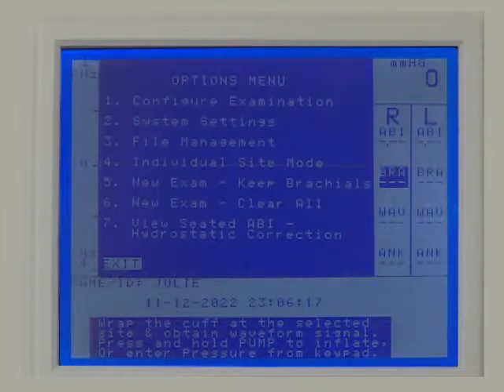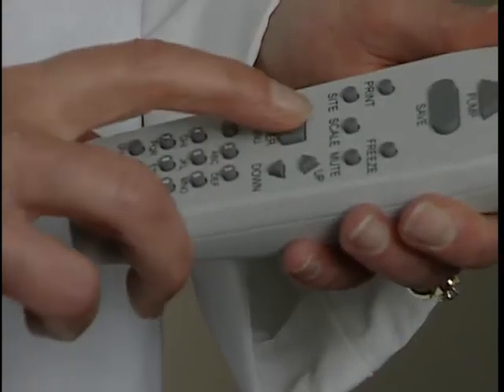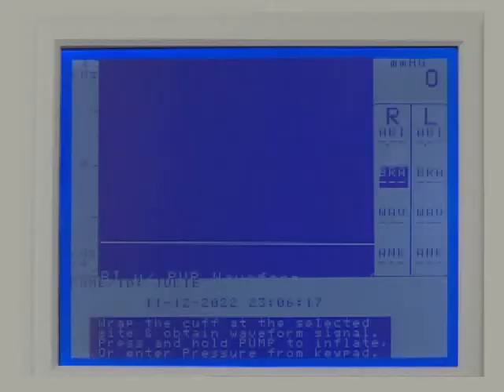To begin, press Enter/Menu to open the options menu. Press 2 for system settings. Unless you plan to use pressures from both the dorsalis pedis and the posterior tibia for determining the ABI, make sure that dual ankle pressure is off by pressing 5 until the setting is off. Press Enter/Menu to exit system settings.